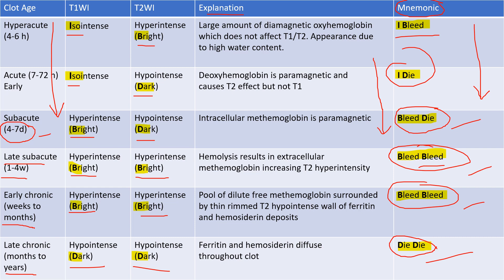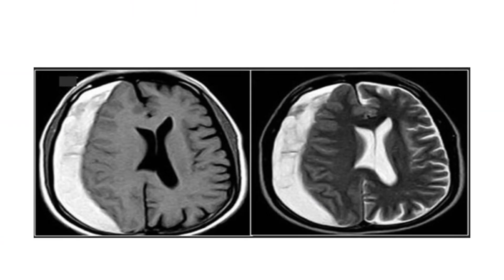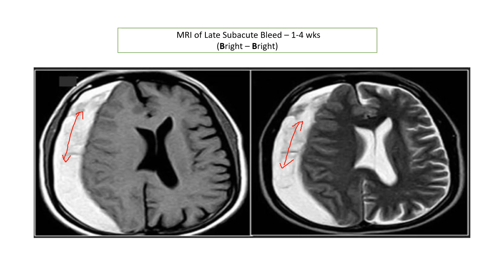Here is another example showing a subdural hematoma on the right side. This T1 image shows a bright signal and the T2 image also shows a bright signal — bright bright, that is 'BLEED BLEED.' So this is a late subacute hematoma, that is one to four weeks old. Try to remember the table by rewinding the video.